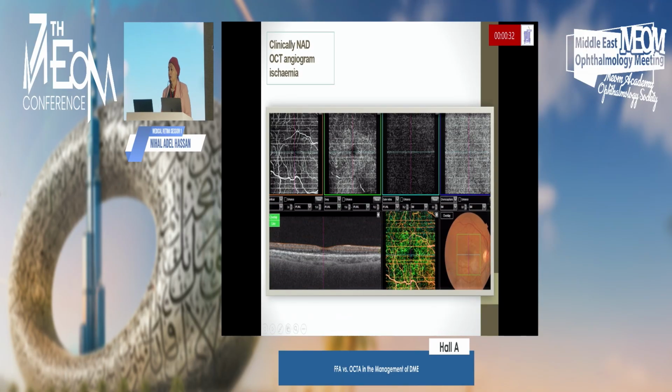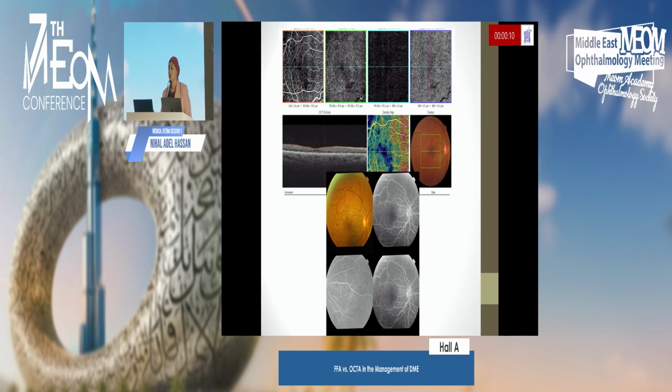Another case in which, by the OCT, there is almost nothing to be concerned with in the macular area. And it's obvious in the OCT angio, though I am using only 4x4, there are capillary dropouts in the periphery with fine irregularity in the foveal avascular zone, but we can see the motion artifacts, because if the patient is not well cooperative, it will have some artifacts.